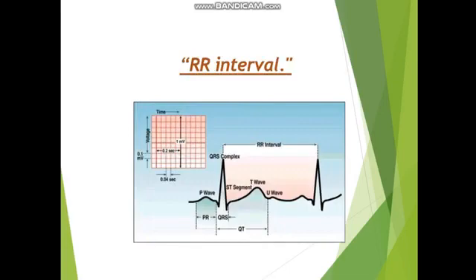The PR interval you are looking at over here starts from the P to the start of the Q. And this is the RR interval. I have already told you, it is the distance between two successive R waves of the QRS complexes.